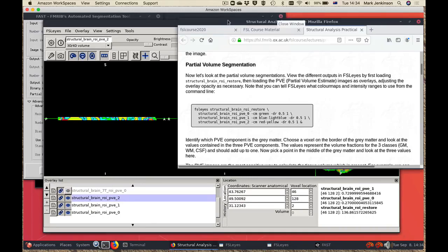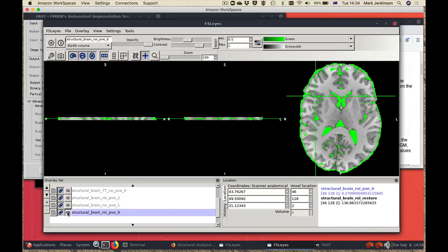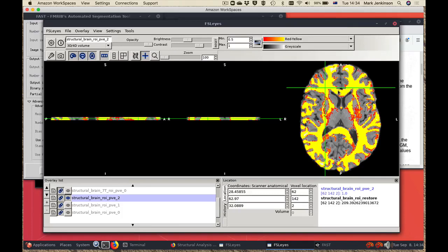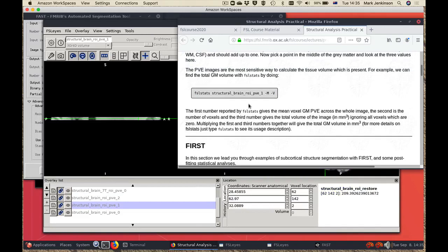Then we look at the partial volume segmentation. There's a specific command that creates an FSLeyes window which opens these things for you. You can toggle off the various different ones, all in different colors, to see where it's created the segmentations and what values it has both in the center of the tissues and at the edges. Finally we do a calculation of the quantity of tissue using the fslstats command. That's the end of the section on FAST, which takes you through how to use it either as a bias correction tool or for segmentation and quantification.